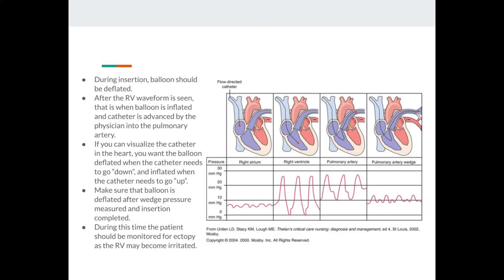We'll be inserting the Swan. And again, typically they will hand you the ends of the Swan balloon to connect your CVP, your PA, your infusion port, and to flush all those out before the Swan's inserted.